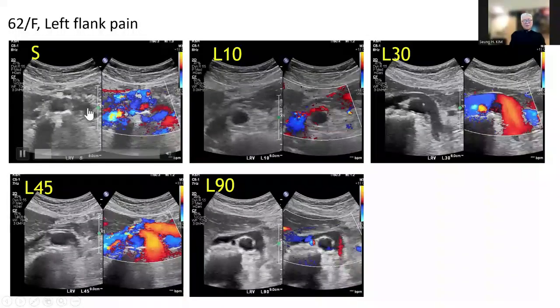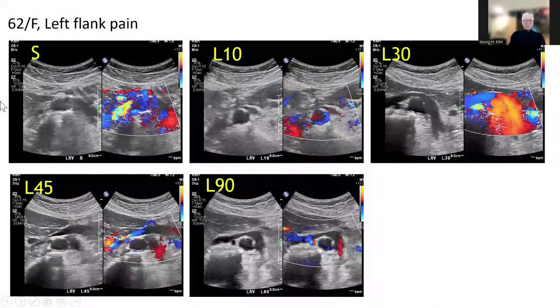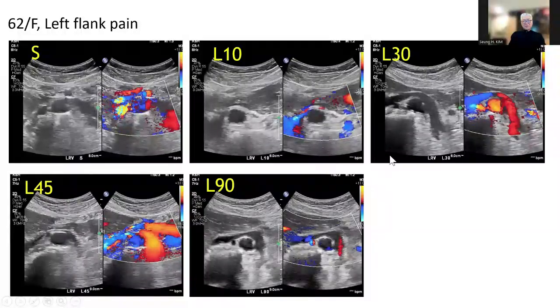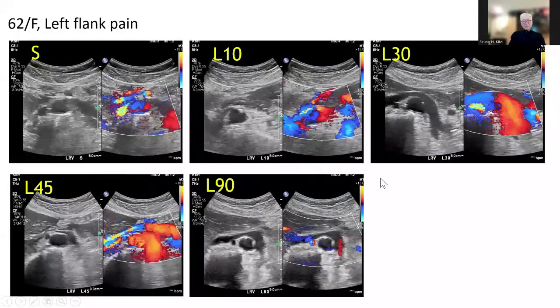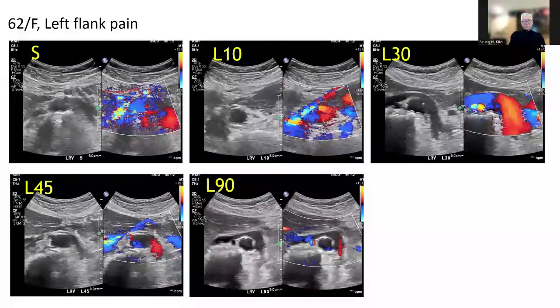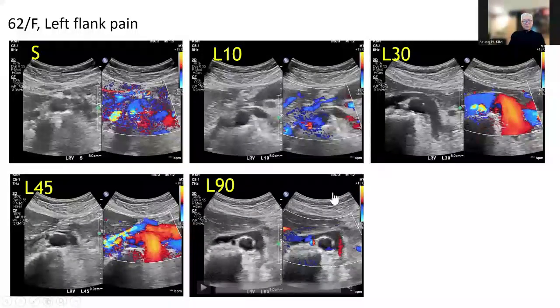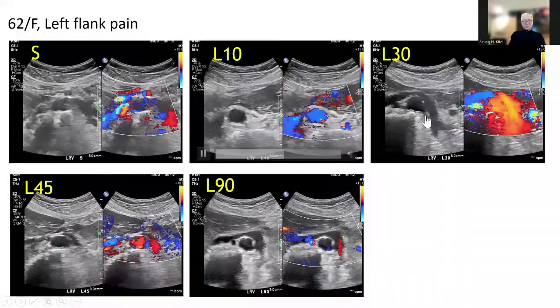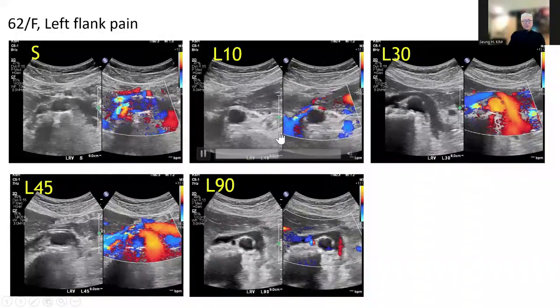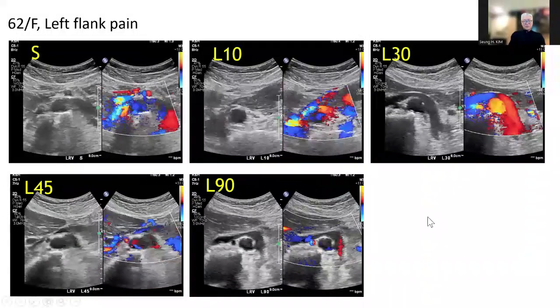It means that if the patient is rotated just a little bit, the flow of the left renal vein may be very different. So it's a very important thing to think about in patient management, asking the patient to change sleeping posture. This is very important, and we can observe this difference simply by doing color ultrasound with the patient gradually rotating to the left side.